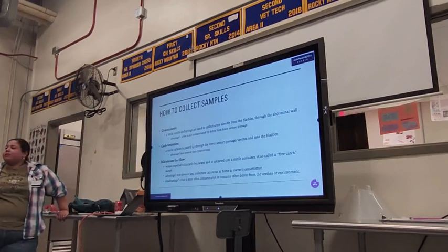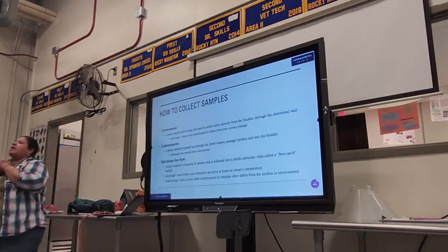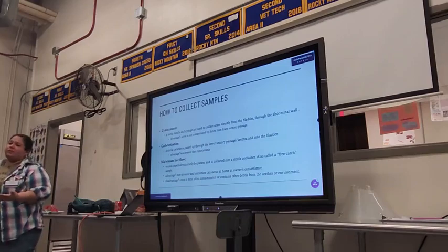And then there's midstream flow. The process you will be using to collect your animal's urine tonight. Once you collect it, put it in a Ziploc bag and try to put it in the fridge. Okay?